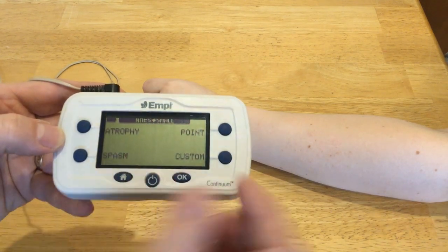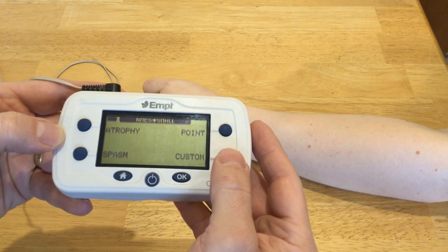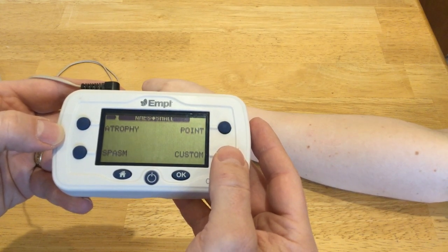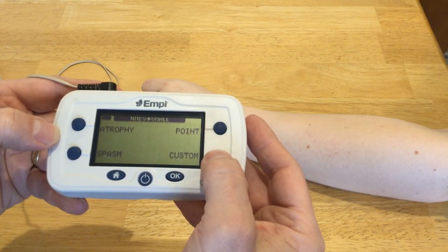Generally if you're going to use any pre-programmed regimens, you really should be looking at the manual so that you know exactly what those do and make sure they do what you want. I tend to just use the custom settings so I can set my own parameters.